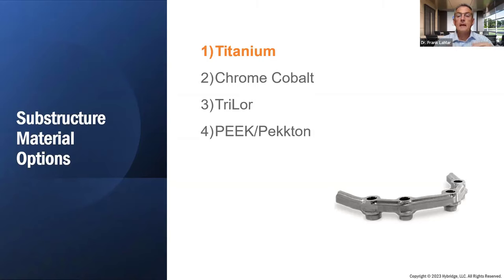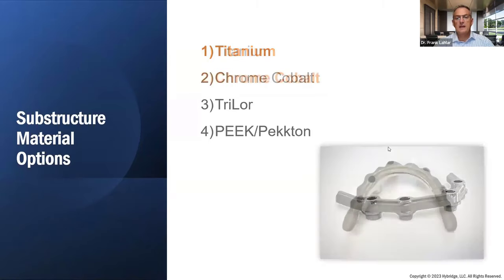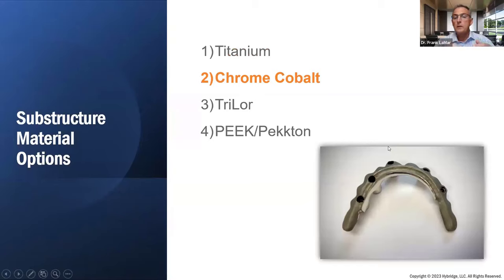Well, I have to say, we were the first laboratory and/or doctors, I believe, out there that decided to take the chance. And we did see some research that said chrome cobalt would be perfectly fine on dental implants. But the issue with titanium is it's really not a metal, it doesn't have any of the characteristics of a really superior substructure. And we'll talk about flexure strength and actually tensile strength and hardness and all that stuff. But titanium just doesn't have it. Chrome cobalt, which is what we use, has much better characteristics as it relates to strength and durability over time.